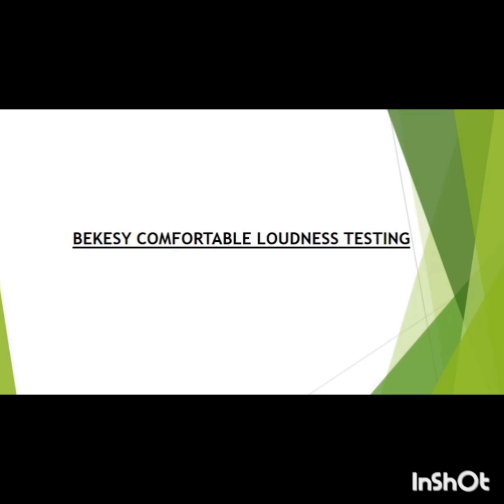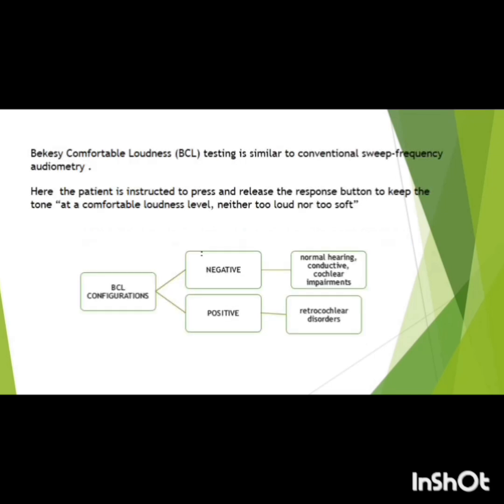Bekesy comfortable loudness testing is similar to sweep frequency audiometry. The only difference is the patient is asked to release the response button at the comfortable level. Bekesy comfortable loudness has 6 configurations, which are broadly categorized into negative and positive. Negative is associated with normal hearing, conductive hearing loss, and cochlear impairment, whereas positive is for retrocochlear pathologies.